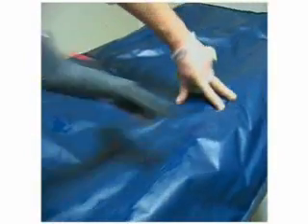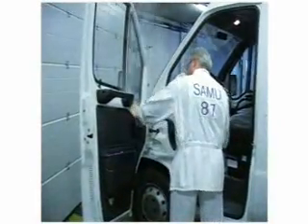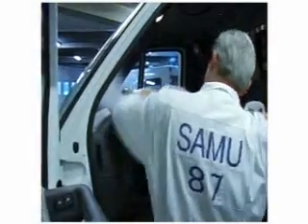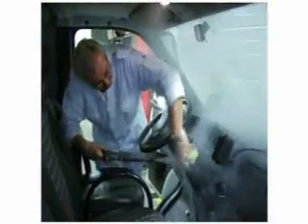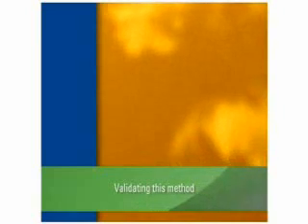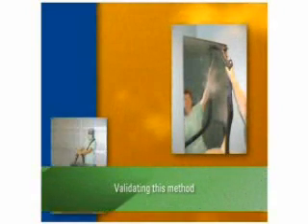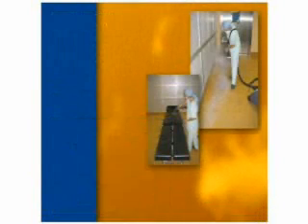The driver's cabin is to be similarly cleaned with special attention to areas in direct contact with the intervention teams. The vehicle is then re-equipped with all the devices steam cleaned beforehand. Can this cleaning and sanitization method using the steam equipment become a real working tool? Can its efficiency be assessed? And is it a practical method? Mr. Joseph Ajar replies to these questions.